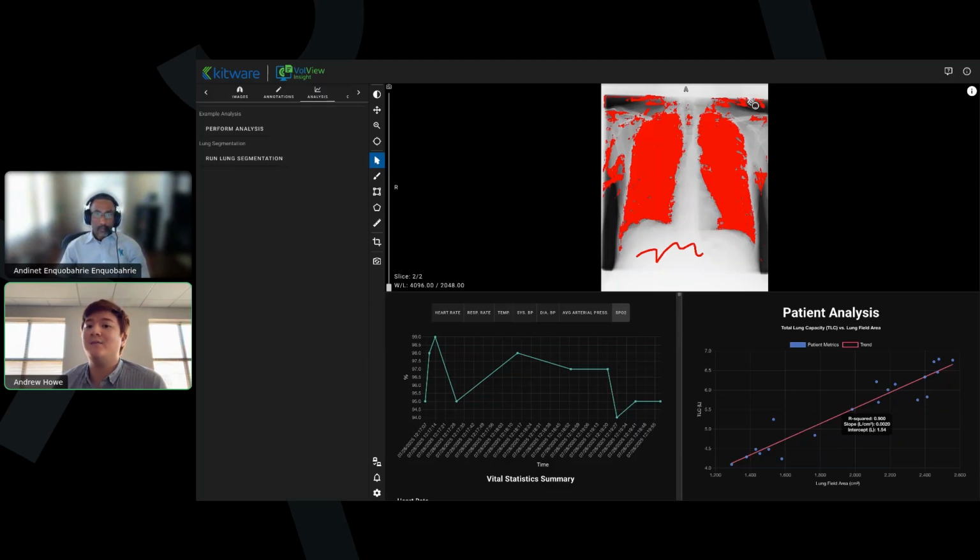Clinicians could be assisted by these models for decision making, and you can even use it maybe for labeling, because you might want to have a system in place where you're testing your model and you want to label the data, whether it got the segmentation right or wrong. In any case, the last thing I want to show is the multimodal data.